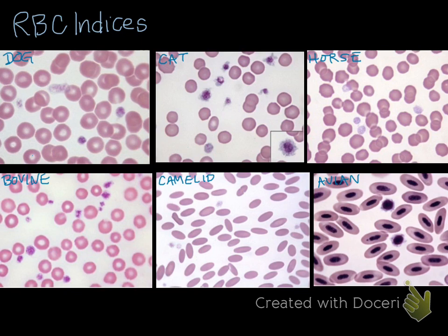The top left picture is a dog, and the dog has central pallor because the red cells are a biconcave disc, and they're kind of our standard size that we compare everyone else to. Cats, which is the middle top, they have smaller red cells which lack central pallor, which are very similar to horses, which are also smaller red cells which lack central pallor, and horses are on the top right.